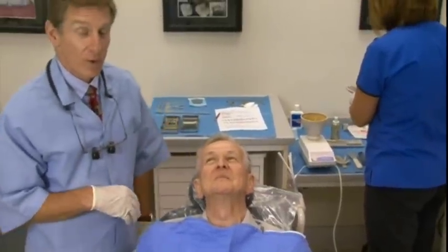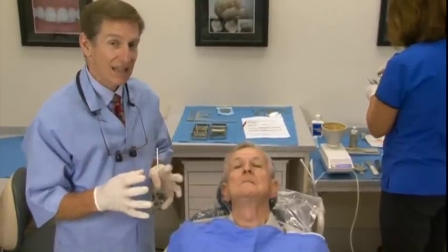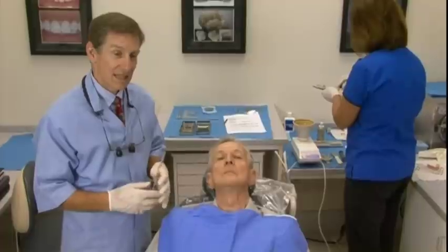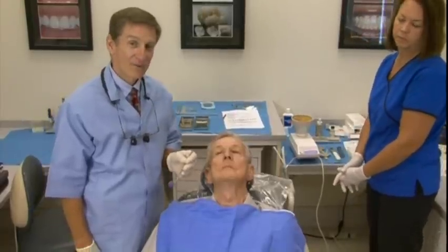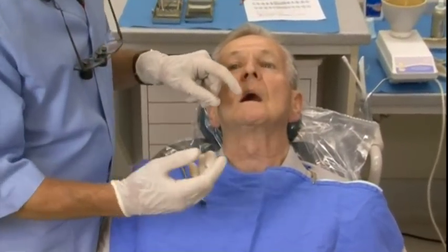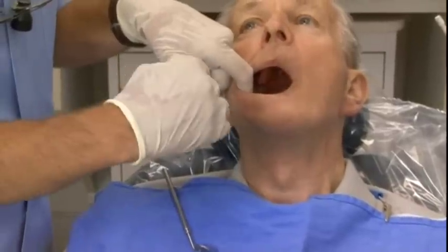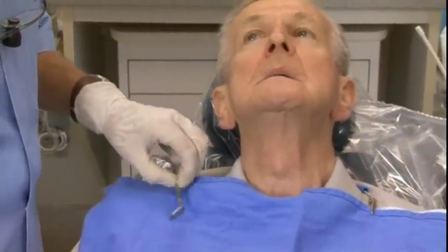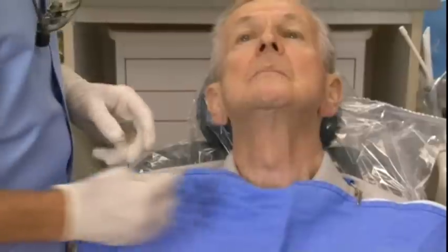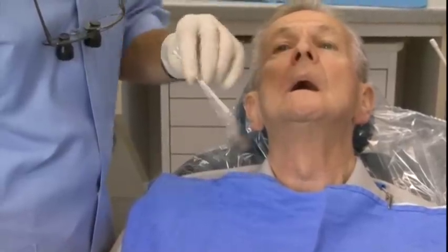I usually like to start with the lower impression — get that one out of the way; it's the hardest one to do. I want you to notice the mirror in my left hand. Part of the problem with getting an impression tray in a patient's mouth is that dentists and assistants use their finger, and you take up all the room in the mouth and can't get the tray in. If you always keep a mirror right there, when I do the lower I'll put it on the right shoulder, upper on the left shoulder. That gives me plenty of room to seat the tray — this is one of the keys to good alginate impressions.